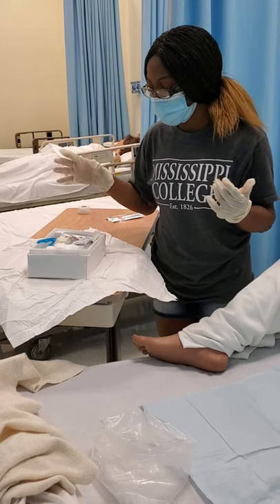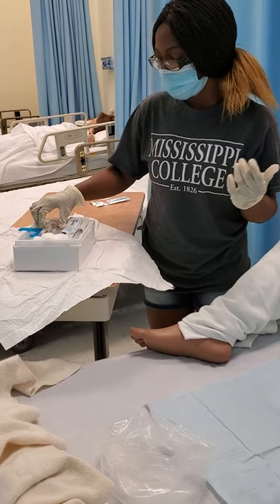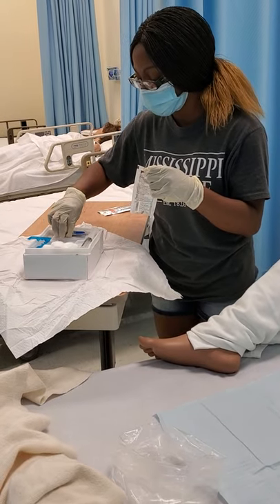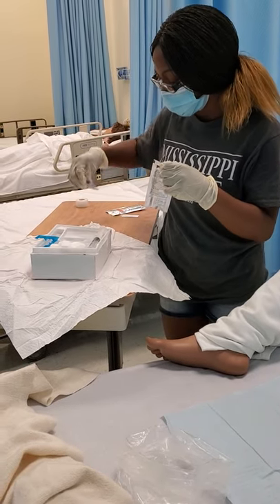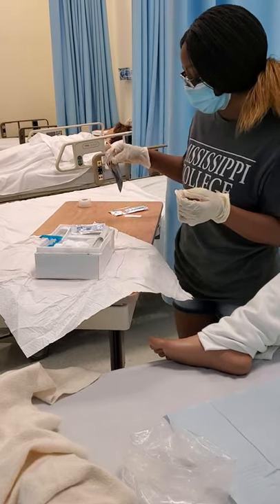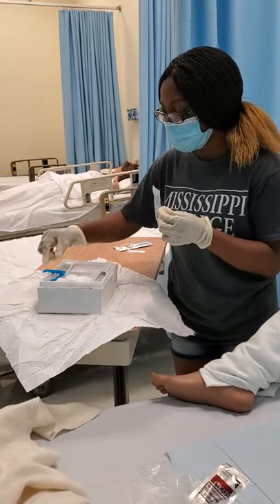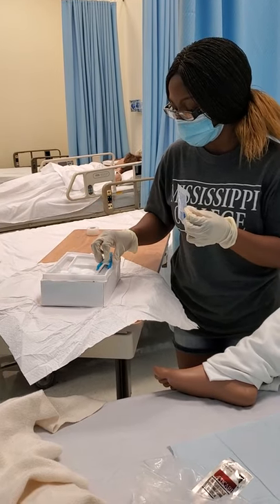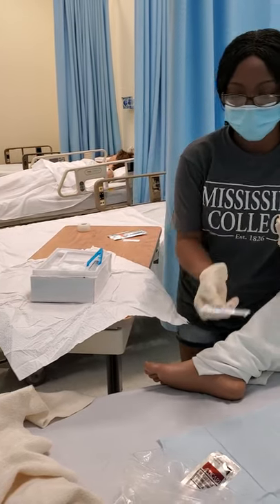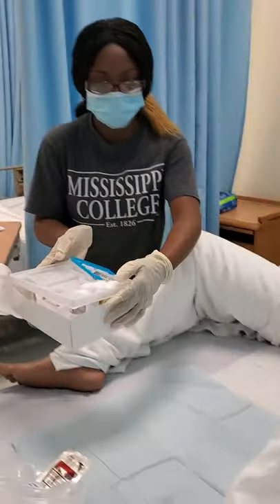Okay. Now I'm going to set up my field. I'm going to open my iodine and I'm going to pour it into the tray. I don't need that either. Okay. Alright, I'm going to discard that. Now I'm going to pour my lubricant into the tray. Okay. And now I'm going to move my sterile tray into the center of the bed.